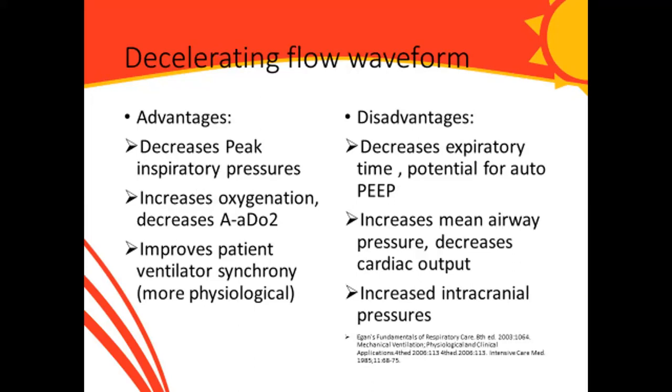The decelerating flow waveform has a lot of advantages because it decreases peak inspiratory pressure. It's better for oxygenation as it decreases the A-a gradient and improves patient-ventilator synchrony.